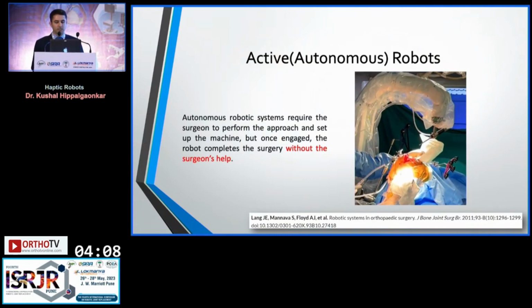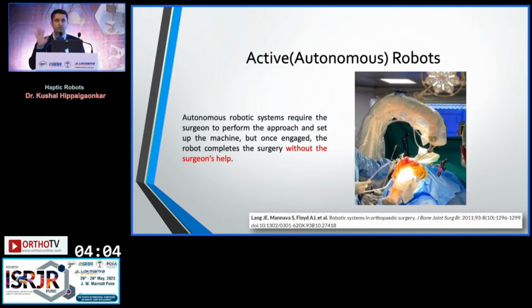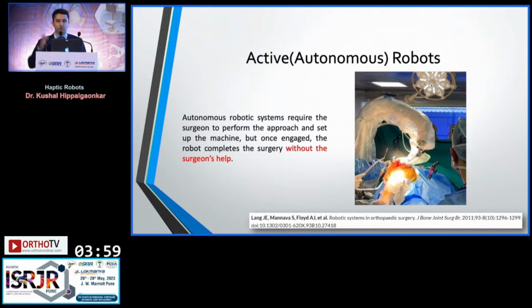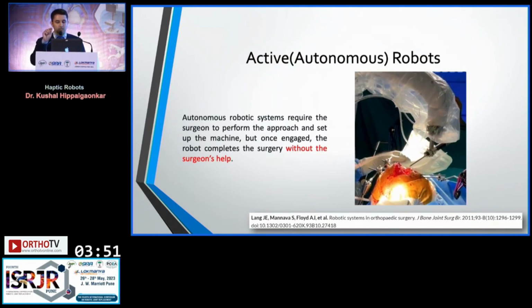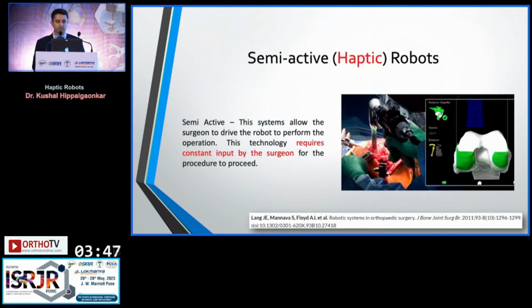So you've already seen this in the QViz just now, where you've put it in. So this is not a haptic robot. This is an autonomous or a fully active robot. There is no surgeon hand involved here. So that will probably be covered in the subsequent talks. But here, the edge of the implant is where the stop for the cutting tool is given.